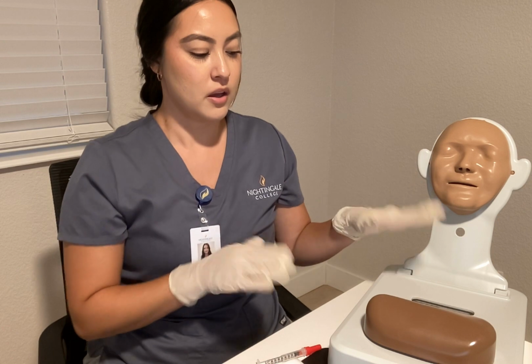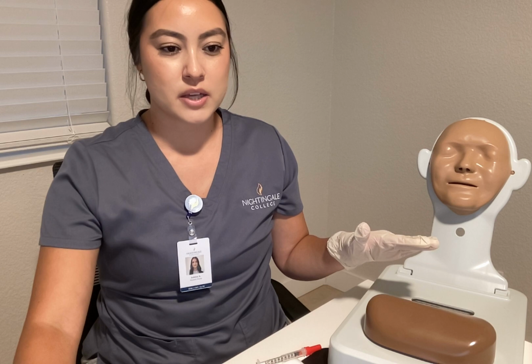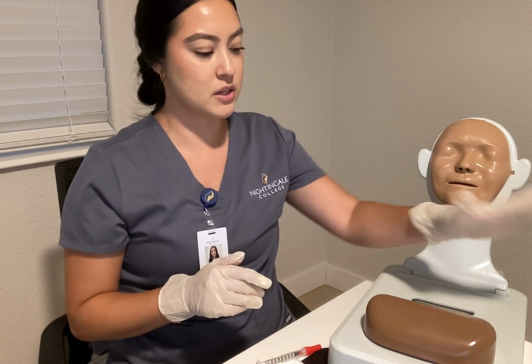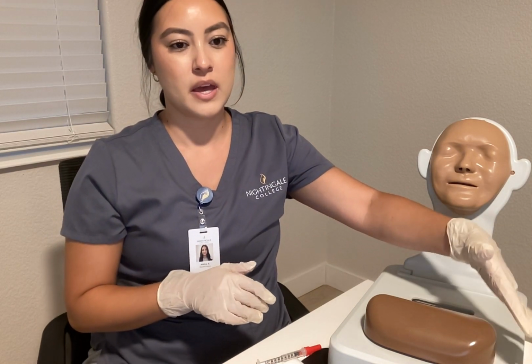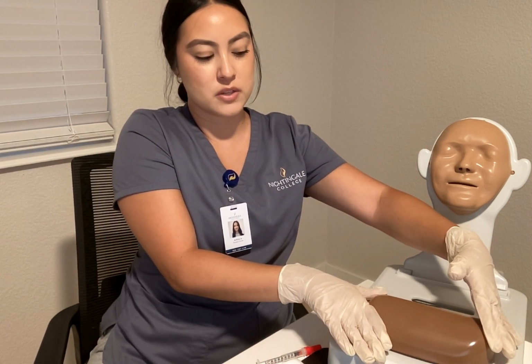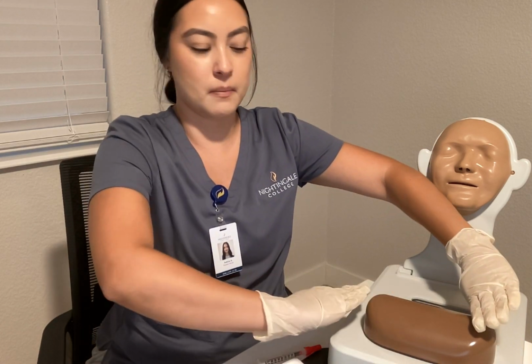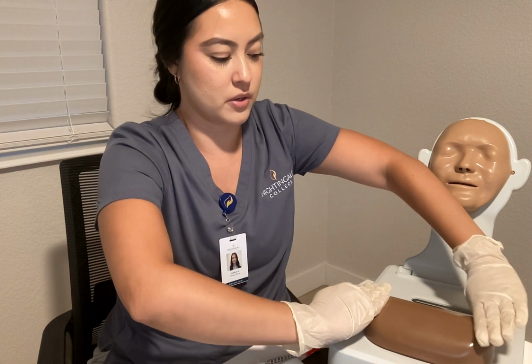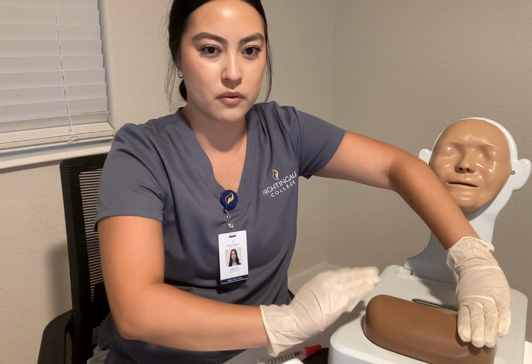Next, I'm going to find the correct area on my patient's arm. So in order to do this, this is going to be his wrist area, and this is going to be his antecubital space. To verify the correct area where we're going to go, we are just going to do the four-finger method from the wrist and the antecubital space, and we're just going to measure here. Once we have done that, we can visually eye in the area where we're going to go.